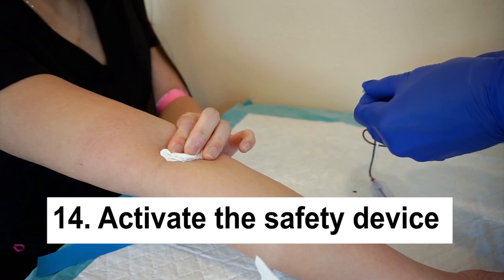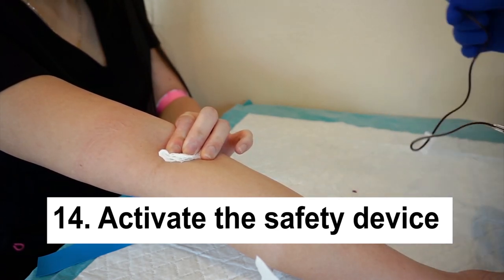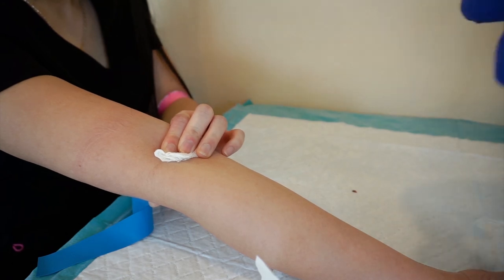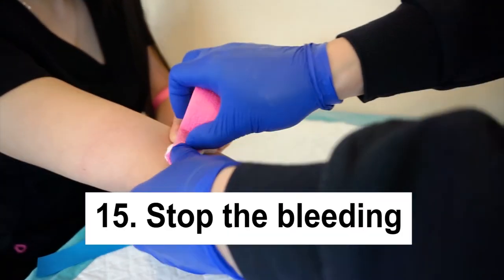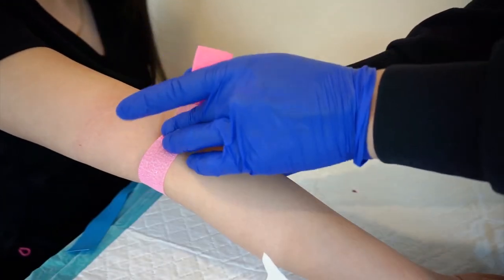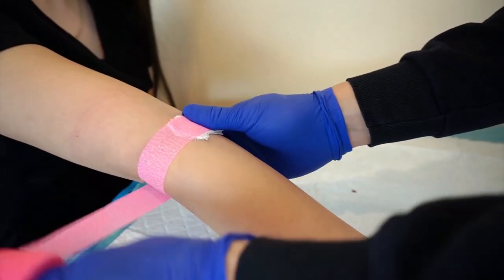Fourteen, once the needle is out of the patient's arm, activate the safety device immediately and throw the needle away in a sharps container. Fifteen, put a bandage on the patient. Then ask the patient to keep pressure on the site for about 10 minutes.